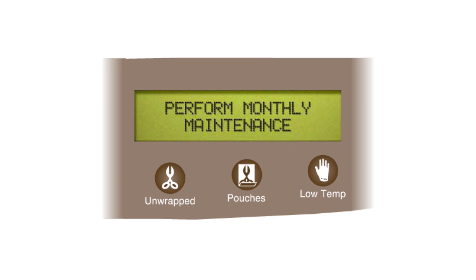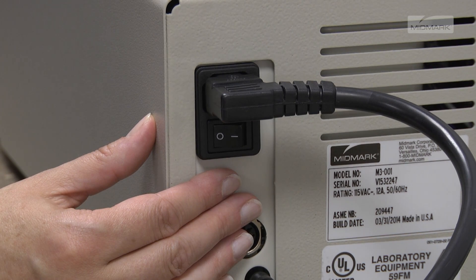The maintenance reminders are removed from the display when the cycle is started. If the power is turned off, the timer will reset, initiating a new cycle of messages.